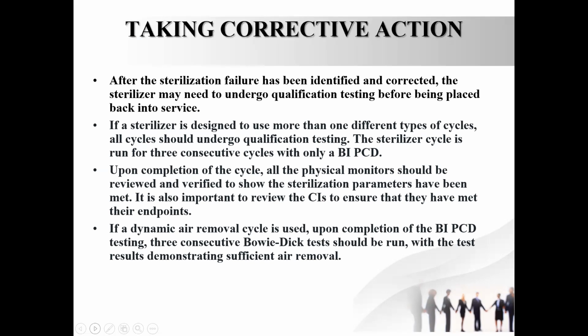After your repairs are over, or you have found out what mistake you have made, the sterilization failure has to be corrected. The sterilizer again has to undergo qualification testing. That means it is being repaired according to your manufacturer, but you have to test whether it is repaired properly.